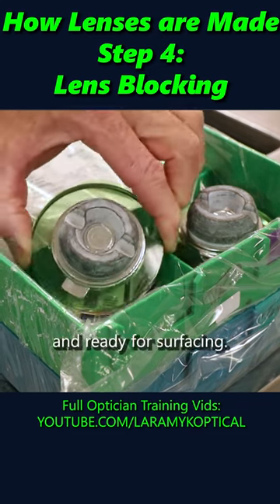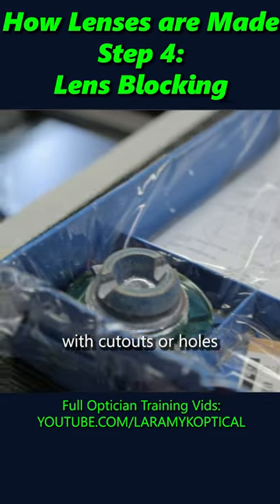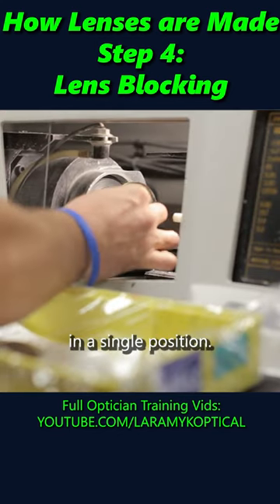This lens is now blocked and ready for surfacing. Notice how the block is designed with cutouts or holes so that it can only be loaded in a single position.